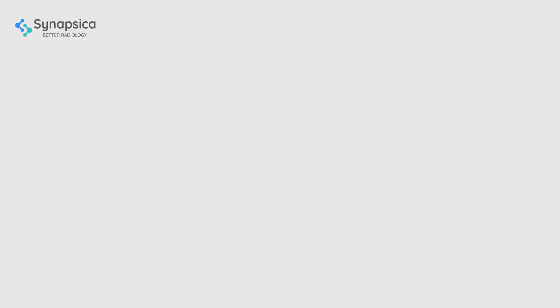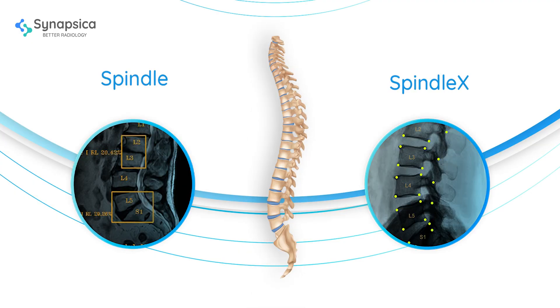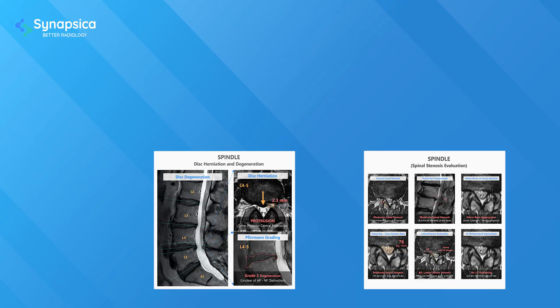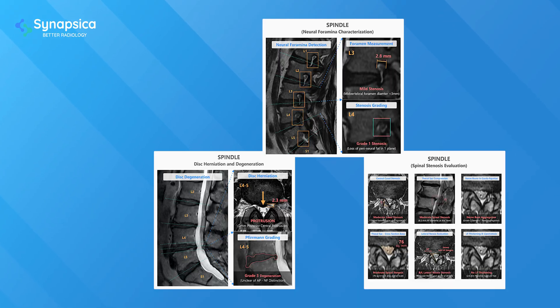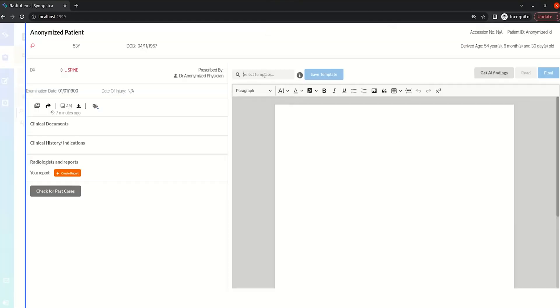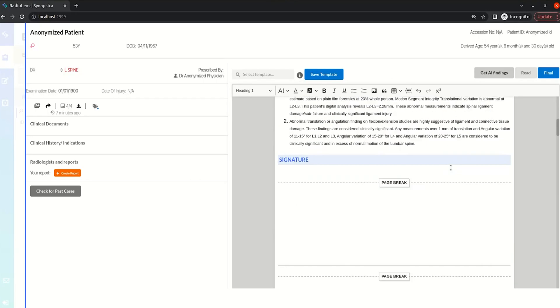And the best part is that Radiolens is integrated with an AI reporting tool that provides quantitative and qualitative reports on various pathologies of the spine, making report generation a lot quicker.